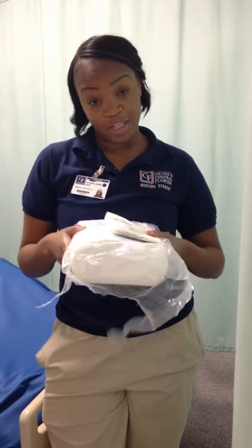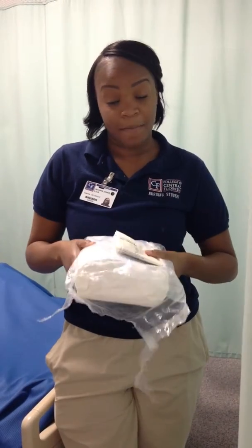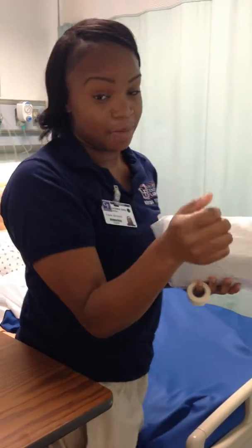Latasha. I'm a student nurse, and I have verified doctor's orders to place a Foley in a patient. I have my supplies. I verified my doctor's orders, and I'm going into my patient's room. Before I go into the room, I'm going to knock on the door. Knock, knock. Come in. I'll close the curtain behind me to provide for privacy.